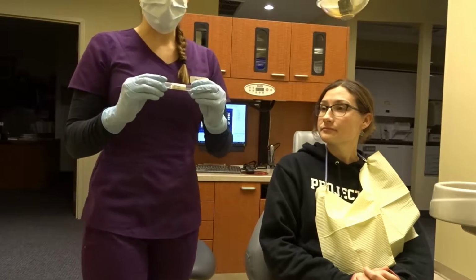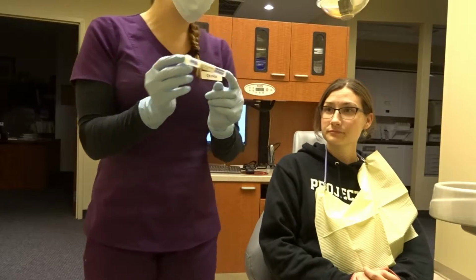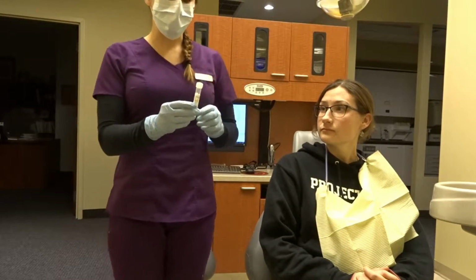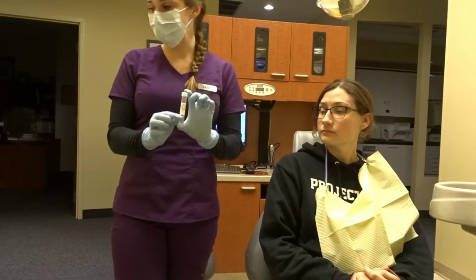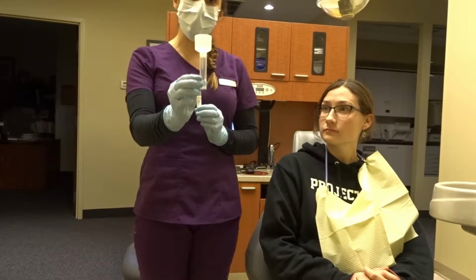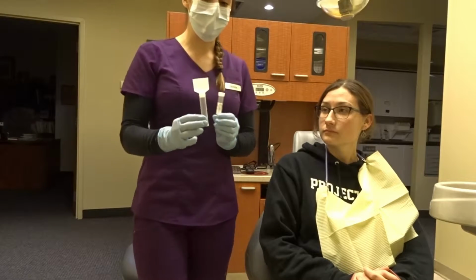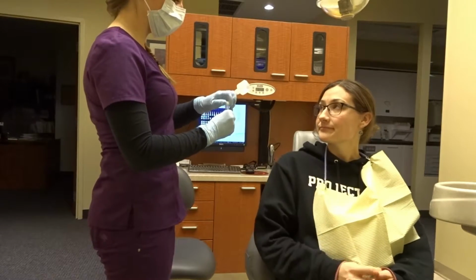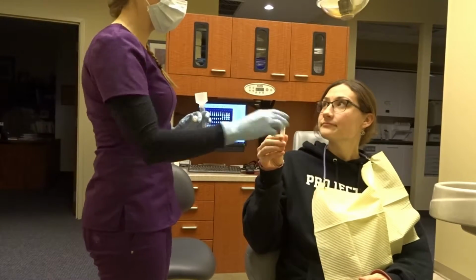This is a saline solution tube that my patient will swish with for 30 seconds. So I will have my patient swish vigorously for 30 seconds, and once that 30 seconds is up, she will expectorate into this tube here. So I'm going to have you swish for 30 seconds with this, and I'll put a timer on for you.